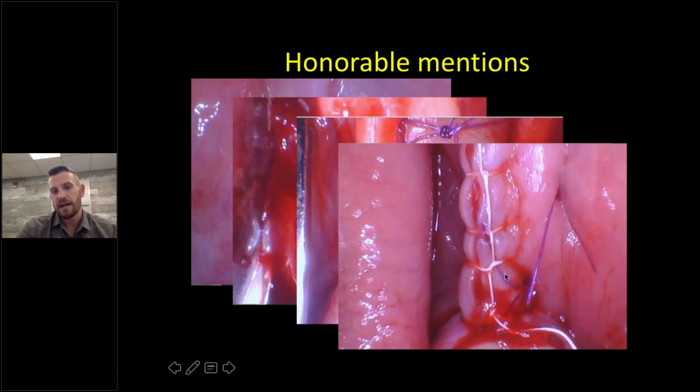And then our passive, tension-free primary closure. The biggest way to get that and be successful is to do your mattress sutures first. Obviously, if you have been doing this, you probably know that already. It's probably more of a rookie tip, but truly to get a nice sound bite of tissue to allow for a good continuous sling suture. And this case was done about 3 months ago, so I don't have a lot of follow-up on this patient yet.